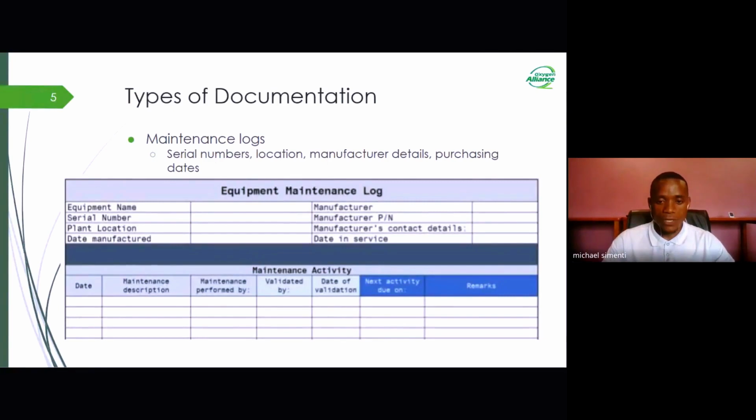These documents enable institutions or health facilities to monitor their system checkup processes, and also to check who has done a certain activity on a medical equipment, at what exact time it was performed, and what the purpose for doing that was. So through documenting all these, it is very easy for you to know if the equipment is performing well and is in compliance with any regulatory requirement.